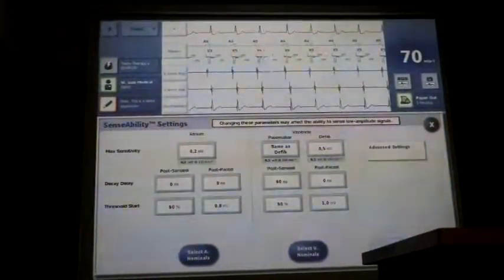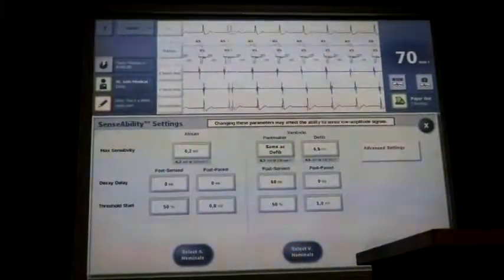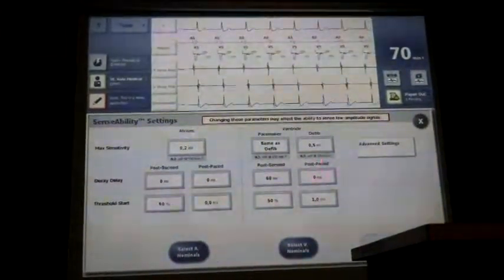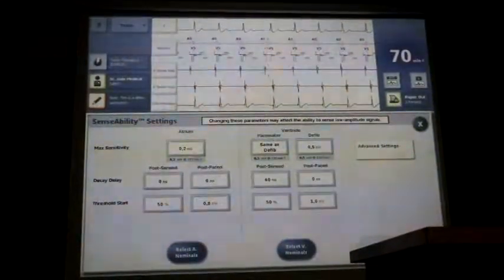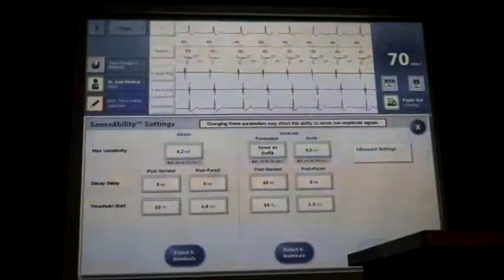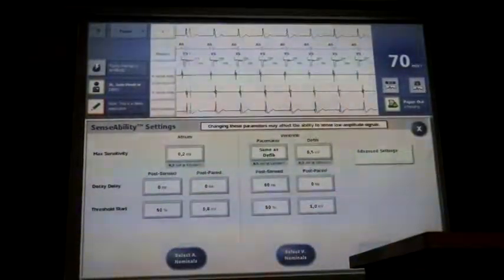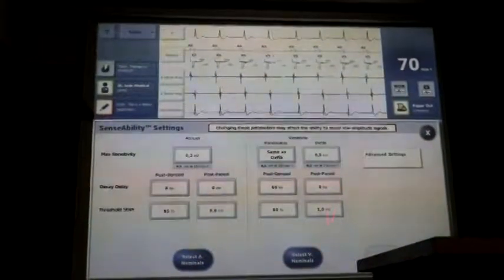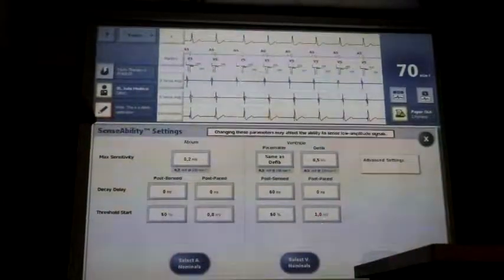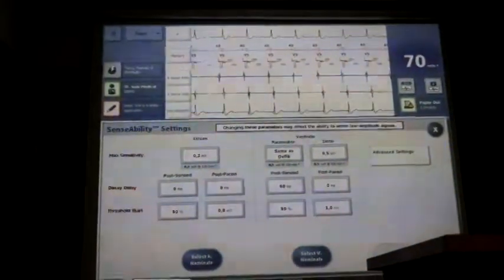What we do sometimes see, as I said earlier, is that there is no T-wave oversensing on Abbott devices when it's sensing. Virtually none with new devices, I haven't seen it. You will see it occasionally when you pace, when you are ventricularly pacing. It never results in inappropriate shock, you'll see why in a minute. So if you get some T-wave oversensing post-pace, you want to be changing these settings here, not these. We may ask you to move this up a little bit to 1.2 or something like this. It just depends on the situation.